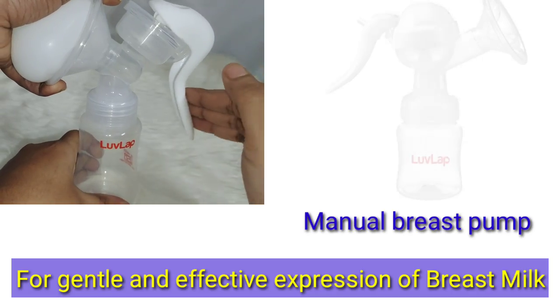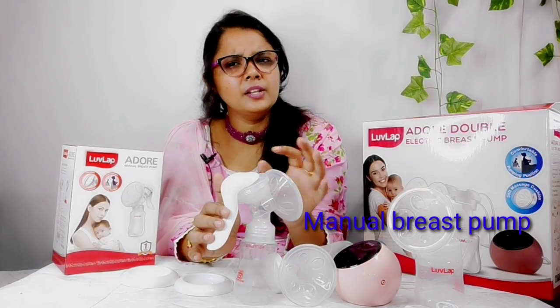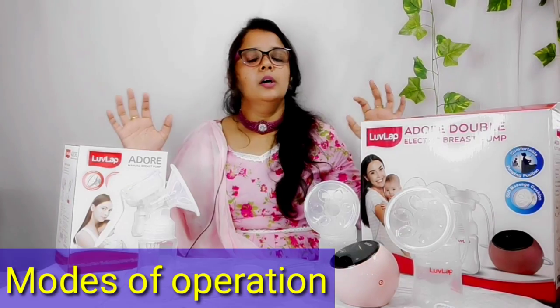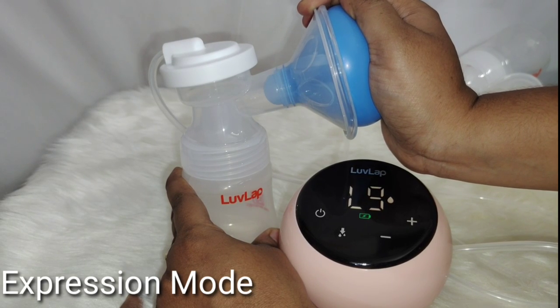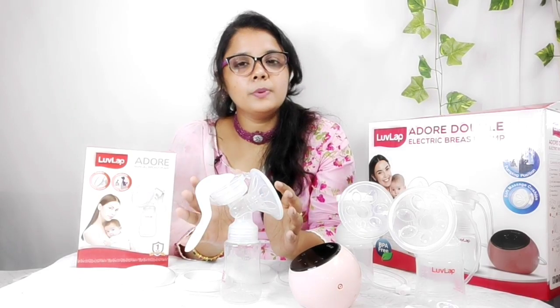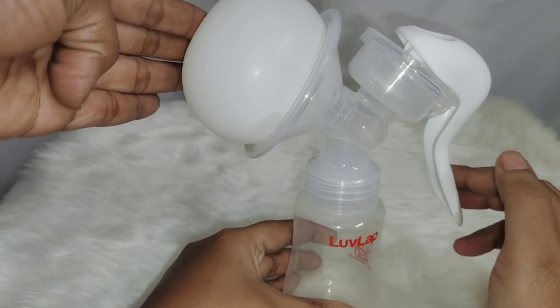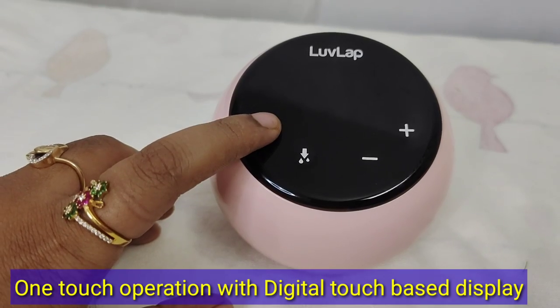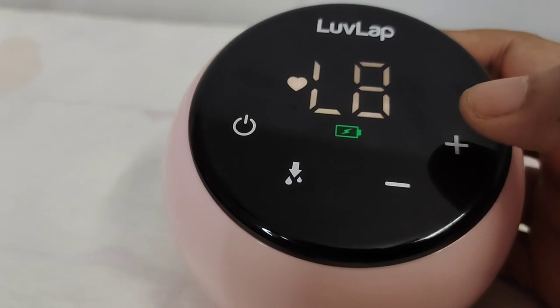The second difference is that there are two modes of operation in the electric breast pump: massage mode and stimulation mode. The manual breast pump has only a single mode, which is expression mode. With the electric breast pump, just one touch operation allows you to adjust it to 9 levels.